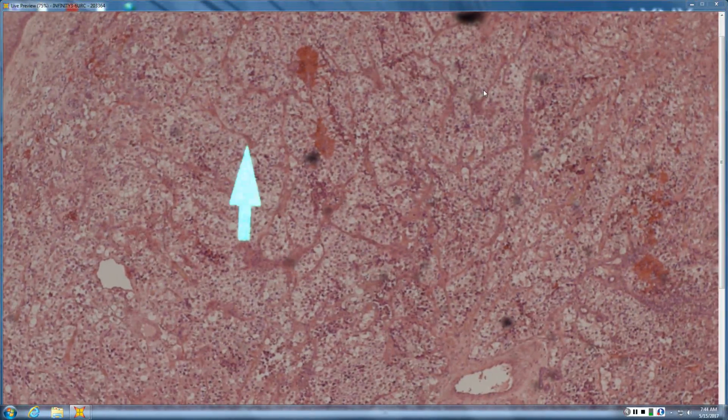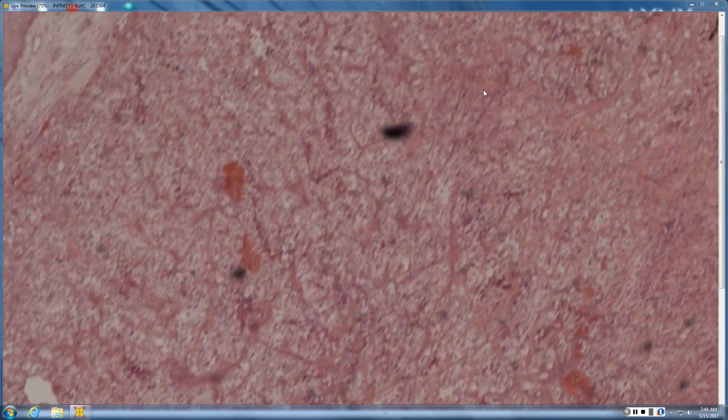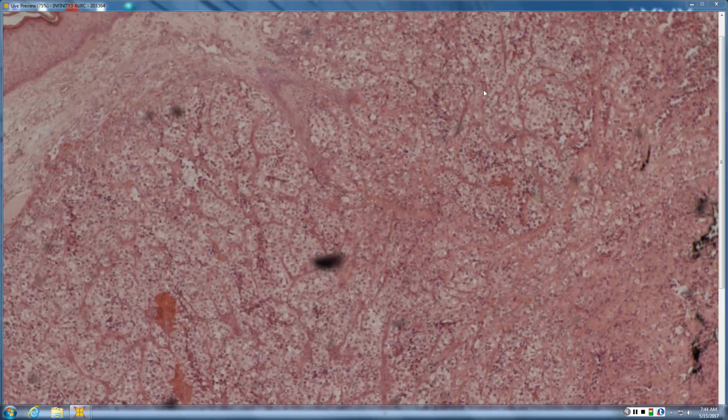So you have tubules composed of clear cells, highly vascular. Renal carcinoma tends to be very bloody, glycogenated, clear. There are some markers. CD10 is pretty reliable. RCC, there's an ever-expanding list of more specific markers for renal. CD10 is sometimes still used as a starting place because it's very sensitive, although not quite as specific.